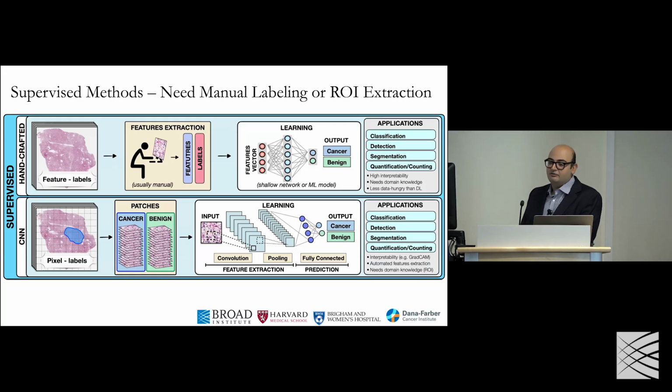However, this is very far removed from how this data is available and collected clinically. So clinically, we don't collect any pixel level annotations on these images. Once you have these annotations, you can separate that data into buckets and use very fundamental deep learning algorithms to classify cancer, normal, subtype, grade, anything.